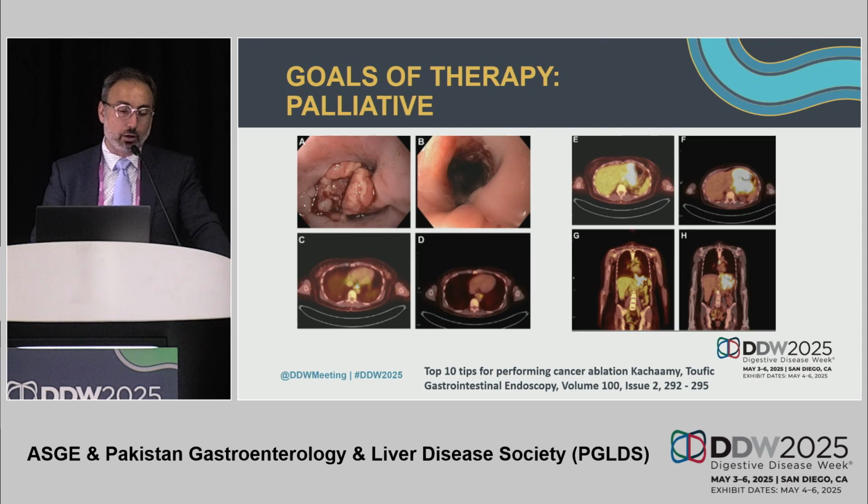You see on the PET before and after treatment that in the esophagus, the activity was significantly less because we were tackling the esophageal part of her tumor, versus in the stomach, where her activity was significantly stronger on the right compared to the left, which is after treatment. So this patient was getting symptomatic improvement despite progression of disease.